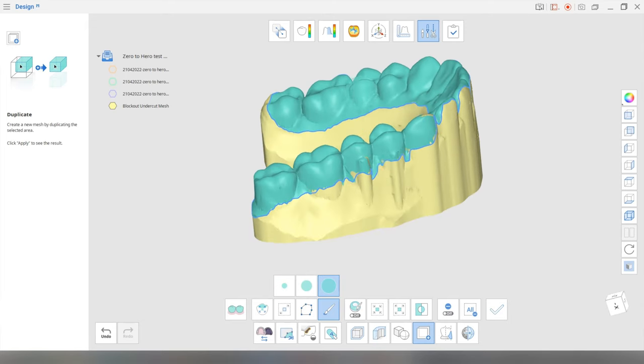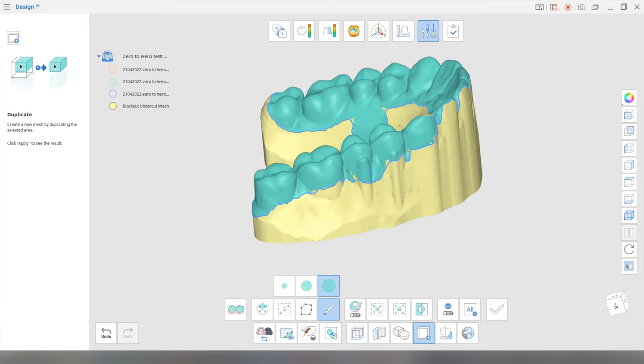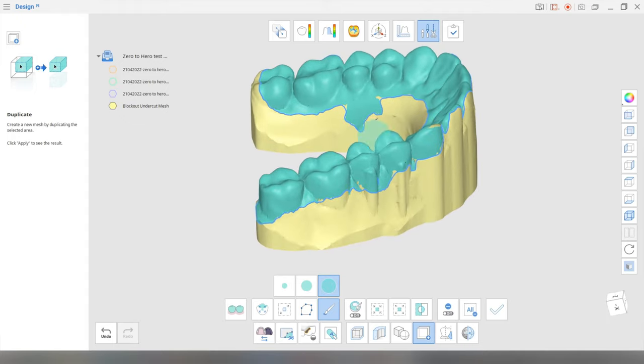So spend some time with this and make sure that you've got everything that you want. The one thing that you have to be careful of is in general 3D software, the view that you take is going to be what's going to be included. So when I'm painting my brush over this model, if let's say I want to include this portion of the arch over here, I paint this over here. You see how the other side is included because it's visible. So you've got to be really careful about where your viewpoint is.